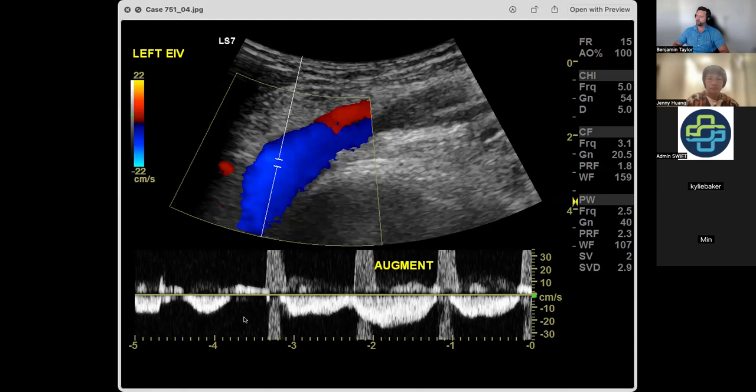So first of all, if the calf was too high up, or more commonly, if it's a big leg and it's resting on the bed, so the veins are already compressed, you might not get much augmentation. And the really tricky ones, you got someone, 130 kilos, your hand can't really go around the leg. The leg's already resting on the bed, so the veins are already pre-compressed. There's not much blood squirt up.